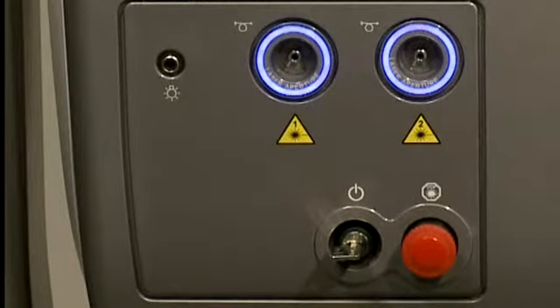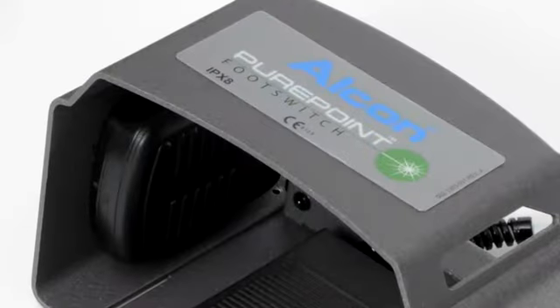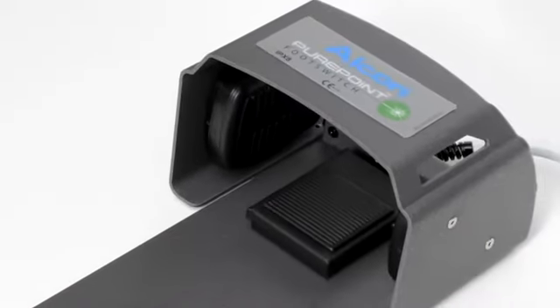As with all lasers, a key is required to turn on the laser unit. In addition, laser power is delivered via a separate foot switch.